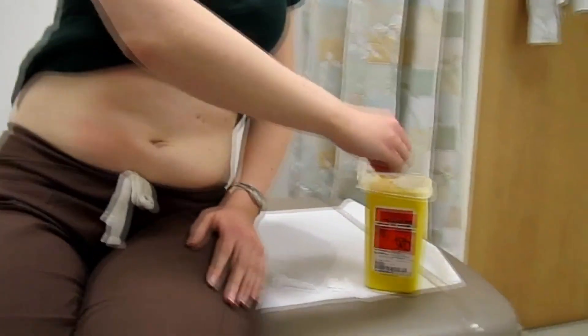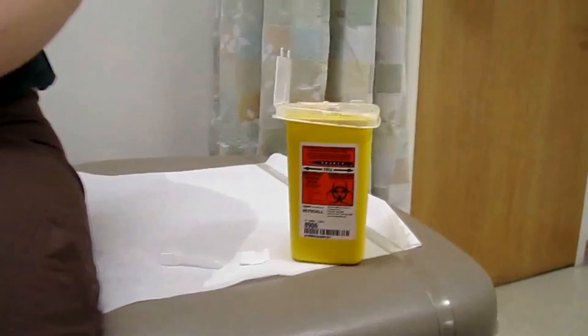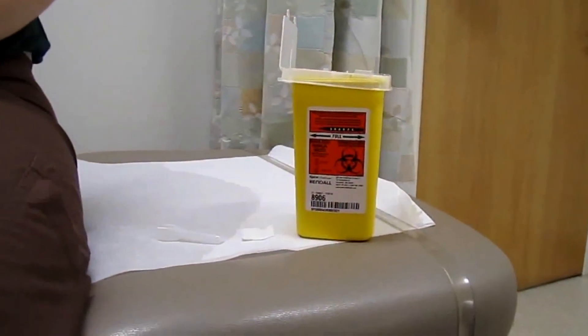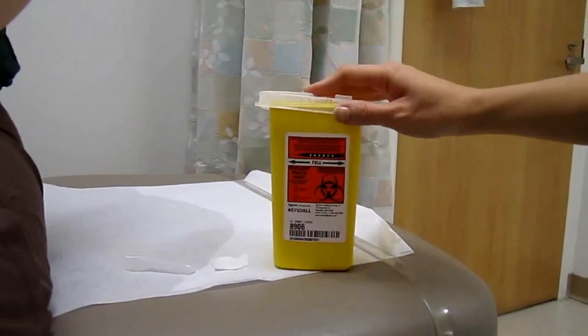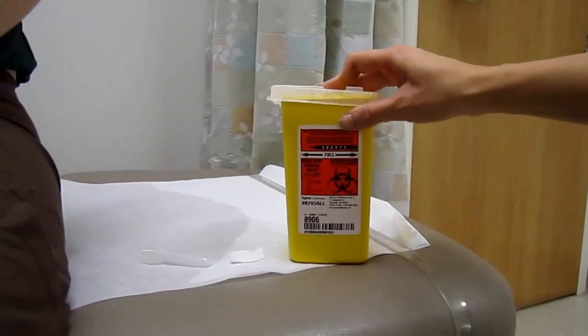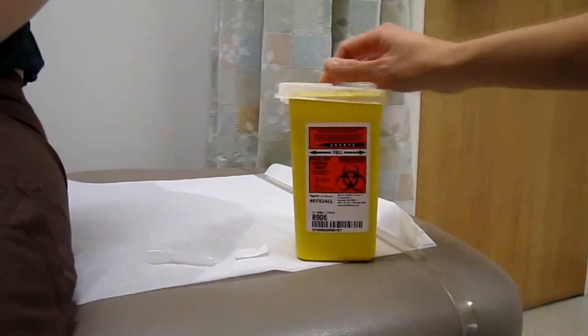Then we're going to take our needle and dispose of it into our sharps container. When your sharps container is three-quarters full, that means it's time to ensure that it's locked up and take it in to your nearest pharmacy for proper disposal.